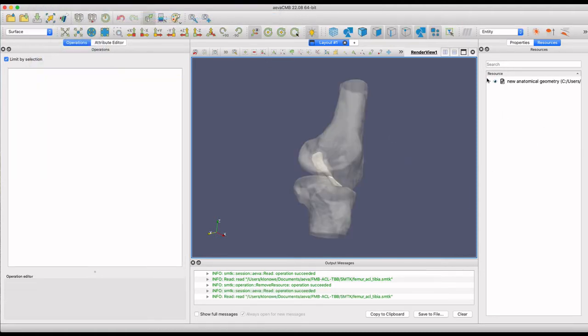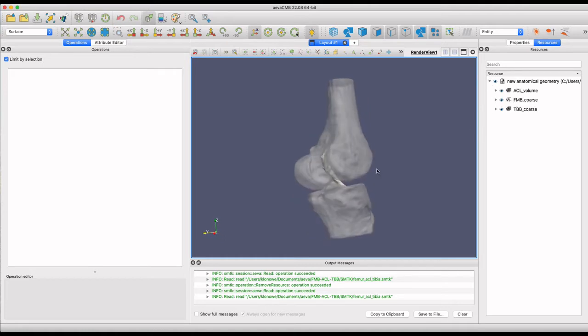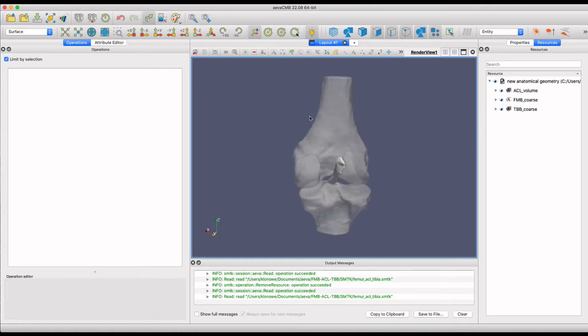Here we have loaded an SMTK file that contains a model of a femur, tibia, and ACL previously created in a separate tutorial.